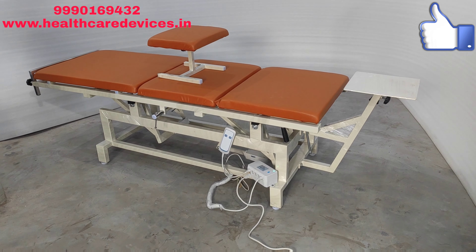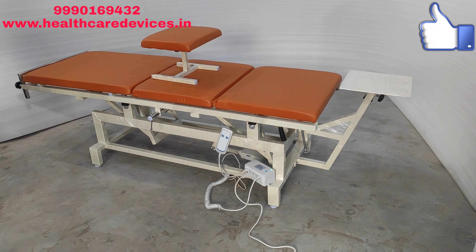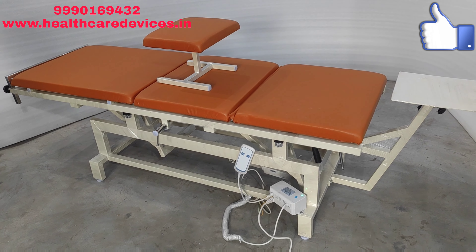Hello friends, how are you guys? I have come again with a better video. So friends, today we are going to demo the high-low bed with traction.